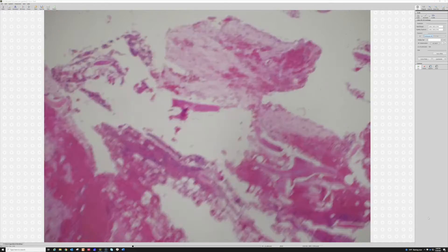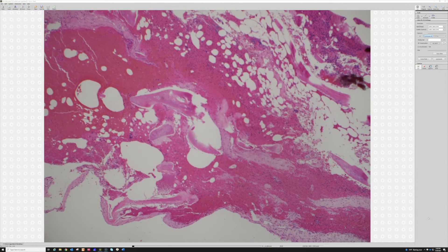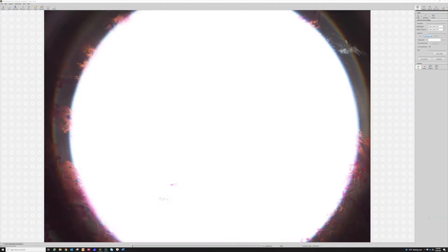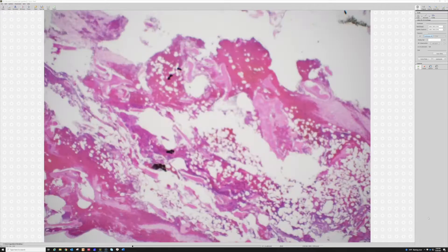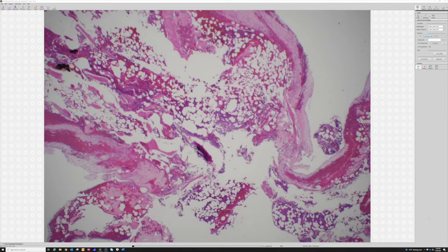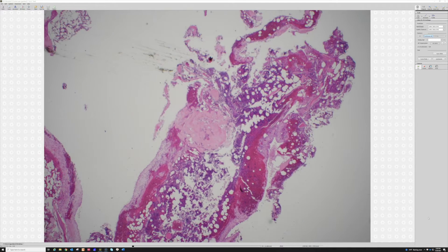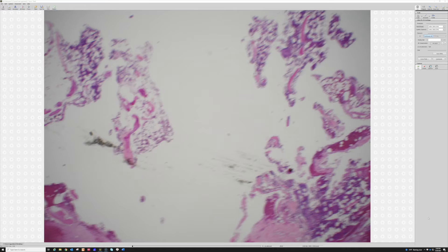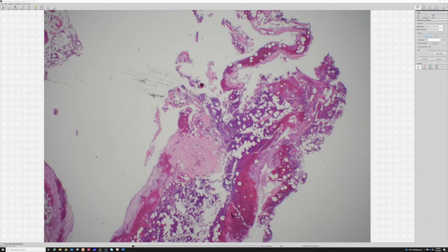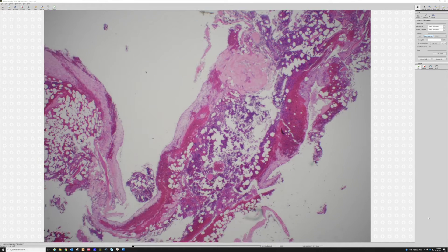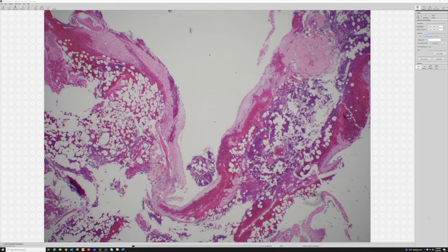Bone is challenging for a lot of reasons, one of which is that oftentimes the types of specimens you're getting from bone are these fragmented curettage specimens. It can become very difficult to get a nice view of the architecture because you're just seeing bits and pieces of the lesion. Radiology is hugely important in bone pathology, and you should always do what you can to get the radiology — or even if you don't have the actual radiographs to visualize, see what the orthopedic surgeon thought based on the radiology.